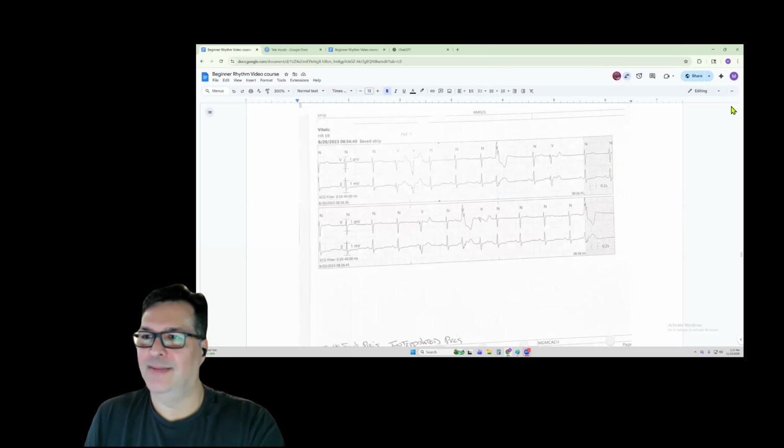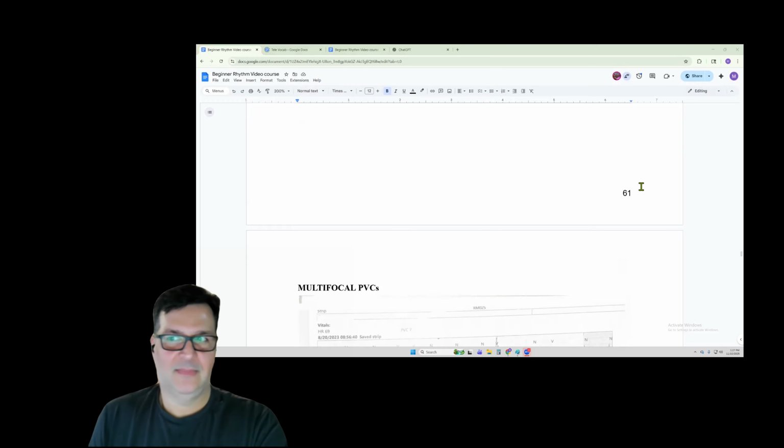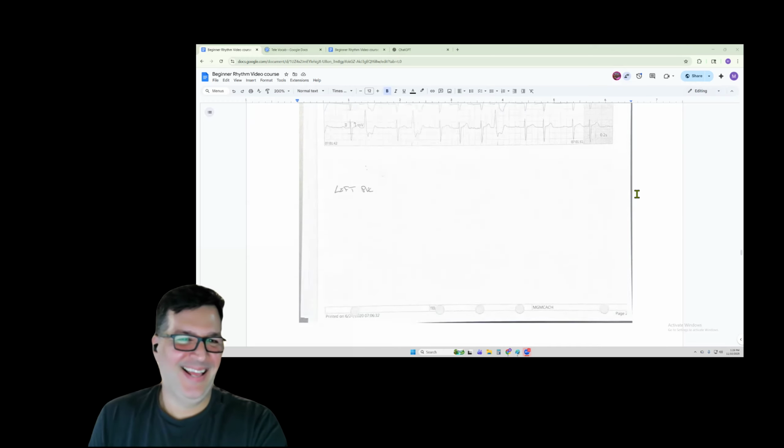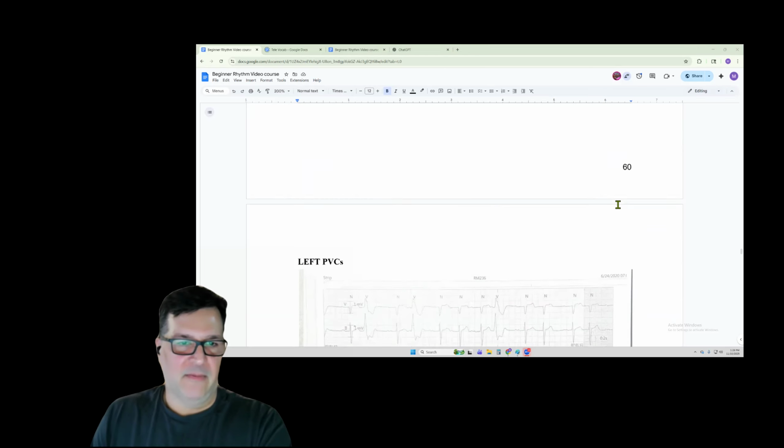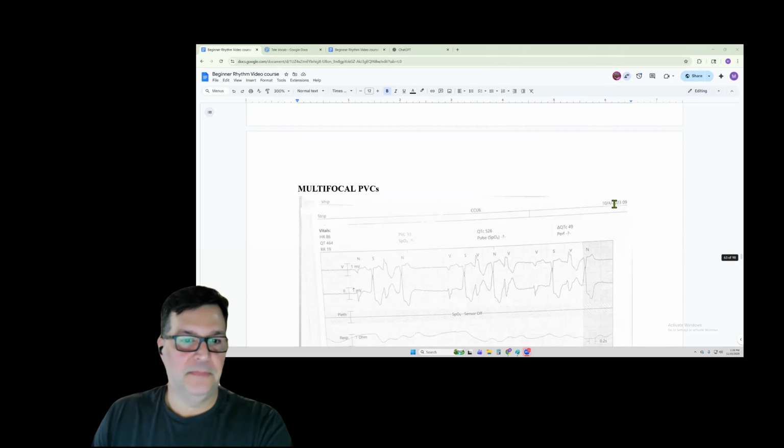See, you learned something today, Krista. Okay, so we're getting down into the ventricle stuff, and if I can find it, sorry, I'm struggling here.